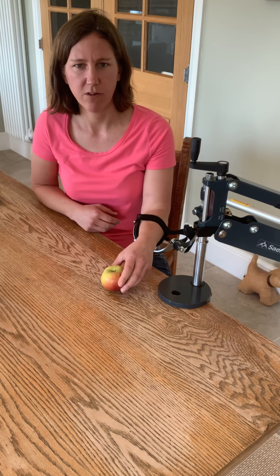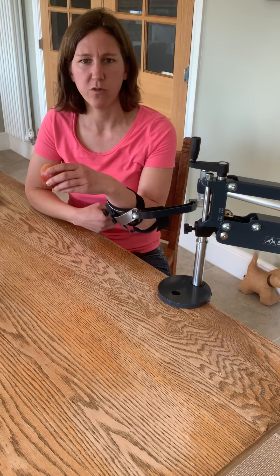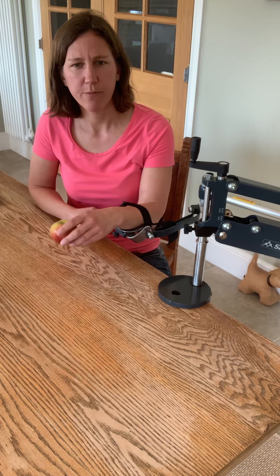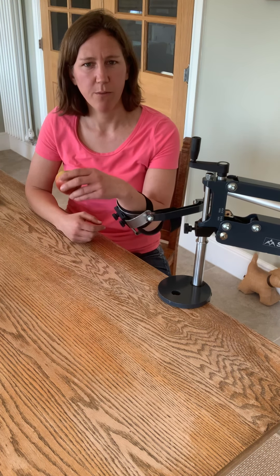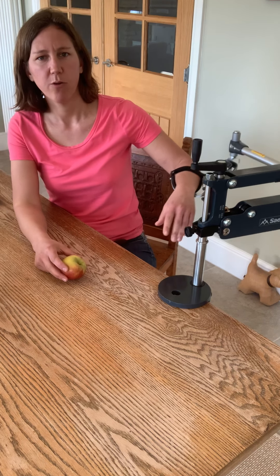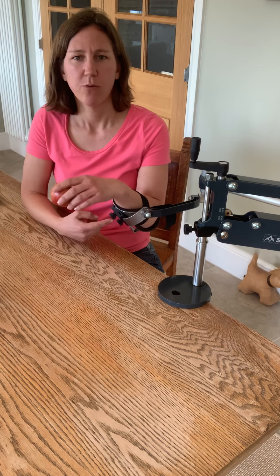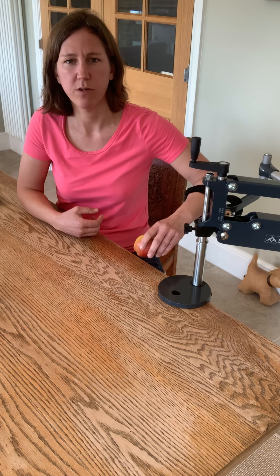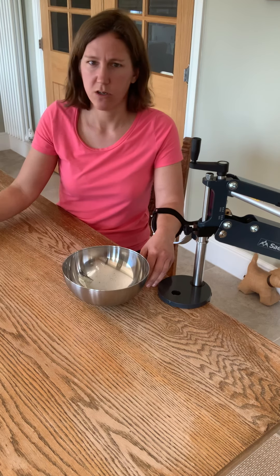If you've got a bit more movement, you could start to pick that up and actually focus on bringing it towards your mouth. Because the Mini-Maz is taking away gravity, it's a little bit easier for me to use my elbow and shoulder movement and my hand isn't clenched in a fist as much. If you need more assistance, turn the tension handle clockwise to lift your arm further. Just be aware that if you keep going, you'll end up at the point where it'll actually lift your arm out to the side — so think about tucking that elbow in as you come up to take a bite, so you don't end up with a chicken wing effect.